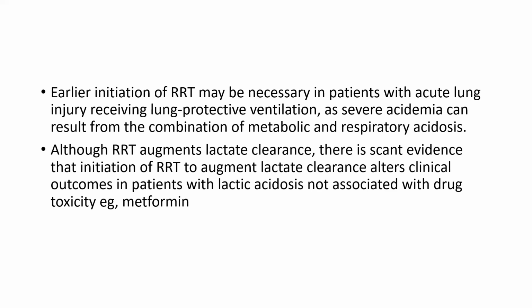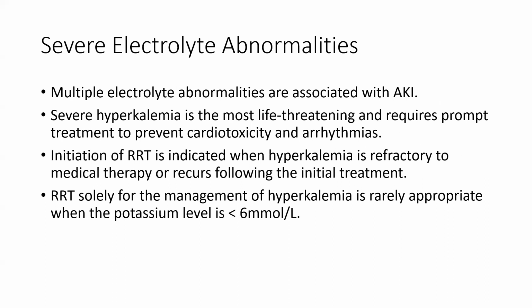Earlier initiation of RRT may be necessary in patients with acute lung injury receiving lung protective ventilation, as severe acidemia can result from a combination of metabolic and respiratory acidosis. Although RRT augments the lactate clearance, there is scant evidence that initiation of RRT to augment lactate clearance alters the clinical outcome in patients with lactic acidosis not associated with drug toxicity, for example, metformin. Now, severe electrolyte abnormality.